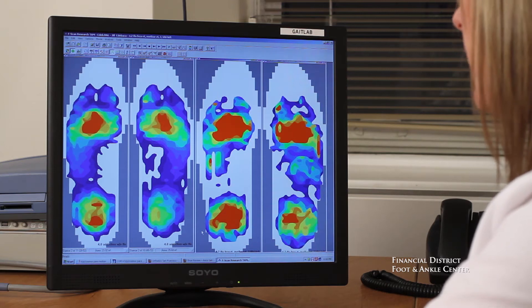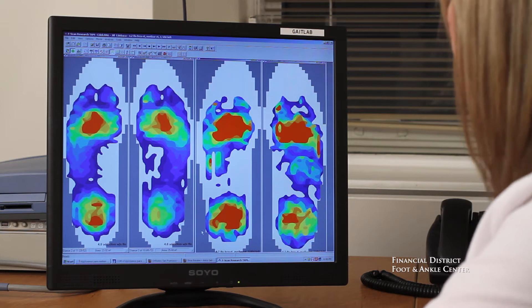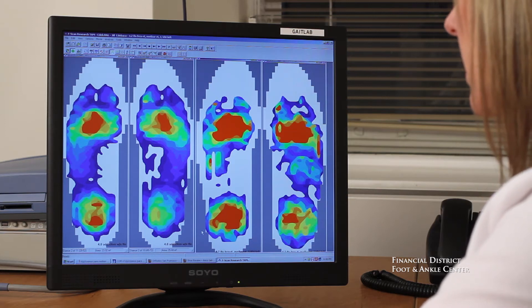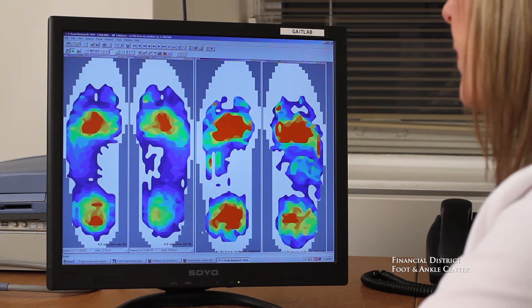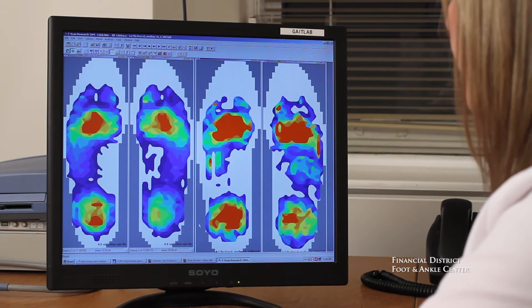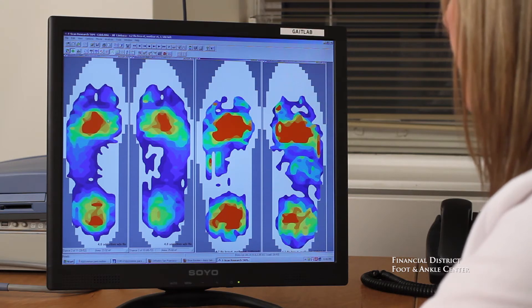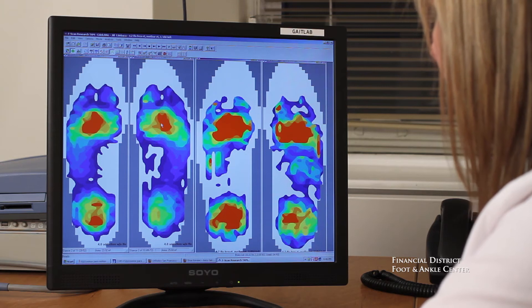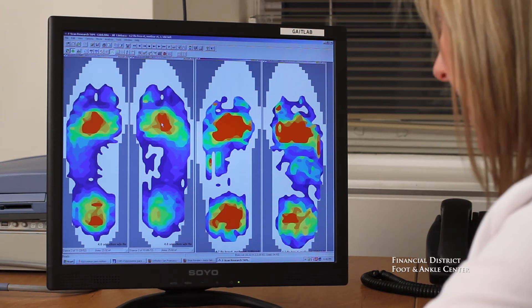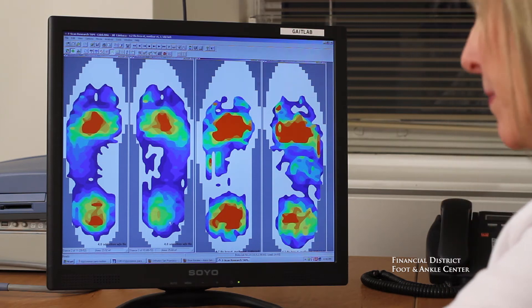The F-Scan pressure insoles system can really help us fine-tune our treatment plan. What F-Scan shows us are essentially three parameters. The first is pressure. This is a before, this is an after. You can see pressure is identified here with the greatest pressure in red, and what we're trying to accomplish with pressure is symmetry.